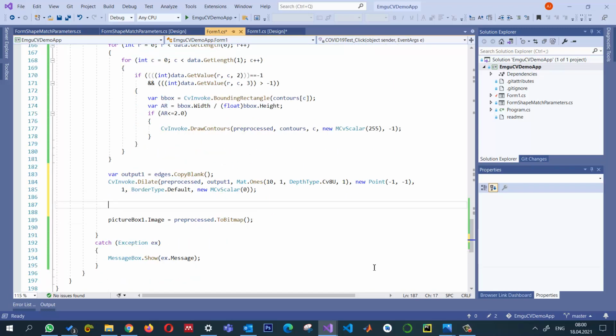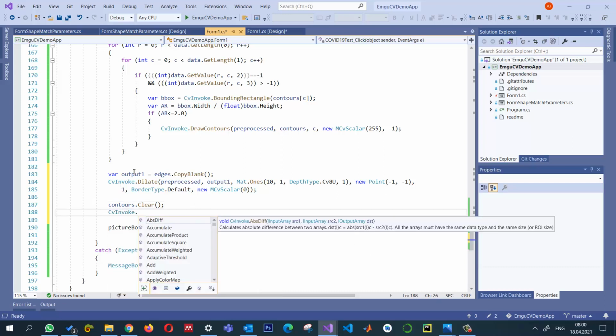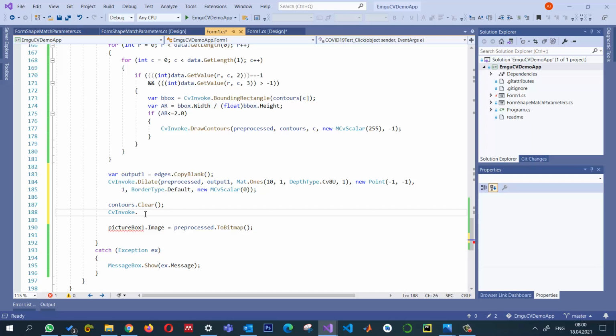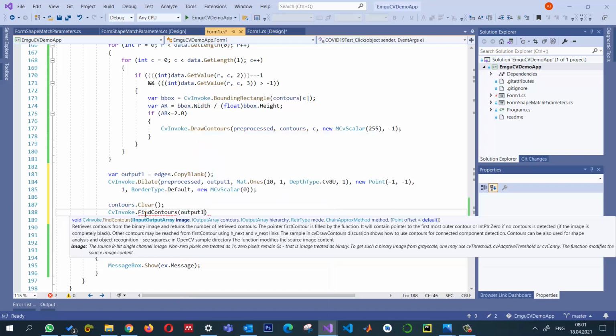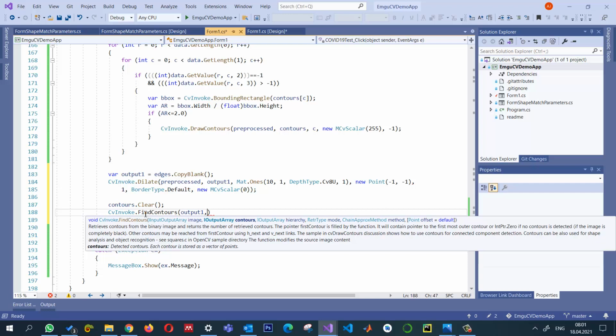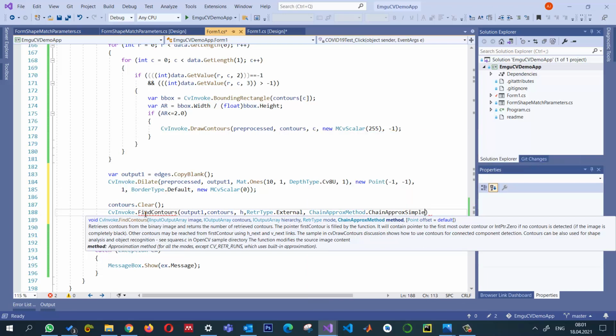And then for that image, I'm going to calculate the contours again. So now the previous contours, I don't need them. I just want to clear them. And again, I will find the contours for this image after dilation. So CvInvoke.FindContours, and we are going to get the contours for output 1, and the contours that we are going to store is in the contours object. The hierarchy is in H, and retrieval type. This time I am only interested in the external contours because we have just one contour that we want for the innermost one. So chain approximation dot simple one, and that's it.